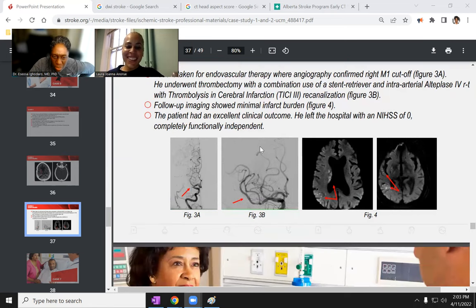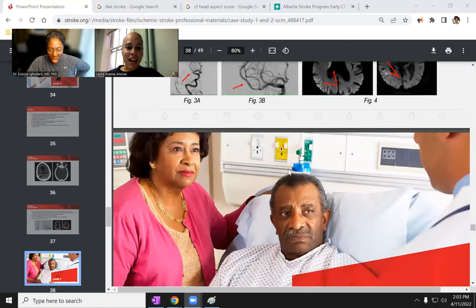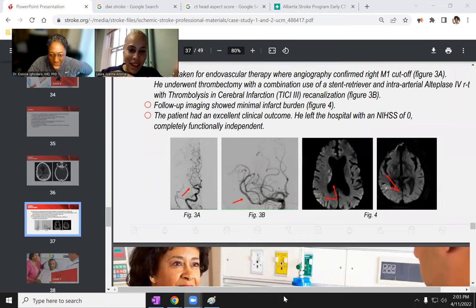Oh, and I wish they would tell us what view this is so we can go and look it up. But I feel like the eyes are towards the back, like the back of the head, and then going front is like, yeah. I don't know, it's a weird view, but at least we know that this is the ICA and this is the MCA. Confident. Confidently. Everything else I could be making up.